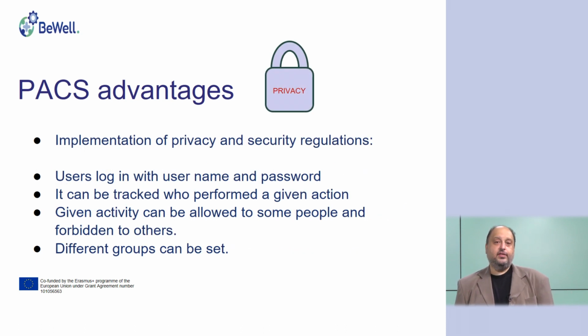The other advantage is that, contrary to some beliefs, PACS may provide better implementation of privacy and security measures. This is because of the access that is provided. Each user has a username and password and logs in with these attributes, and it may be tracked who entered the system and what activity was performed.